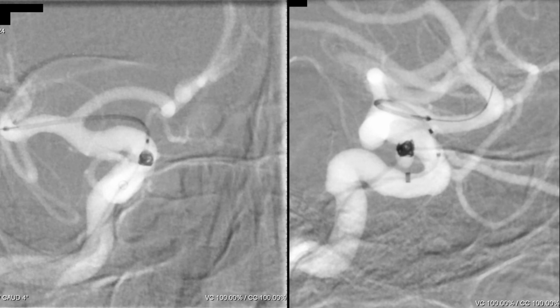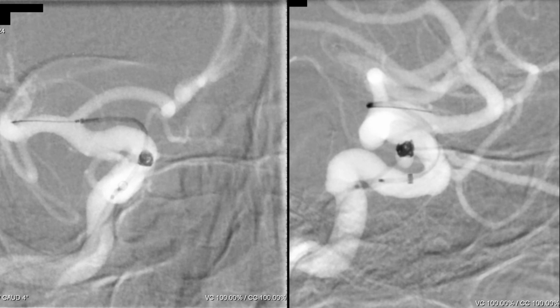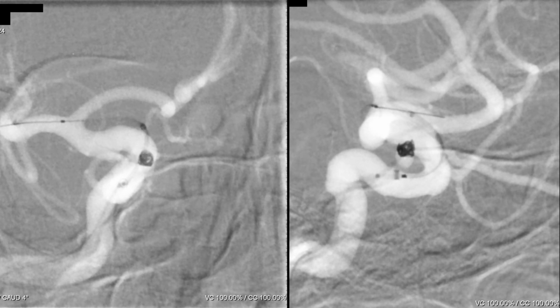As you can see, the dark segment is the flow diverter, and a little bit distally there is the pusher. And now is the tip of the flow diverter at the ICA bifurcation, and now we can start unsheathing the flow diverter.